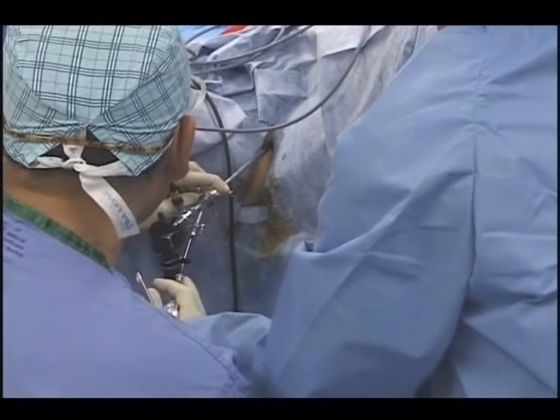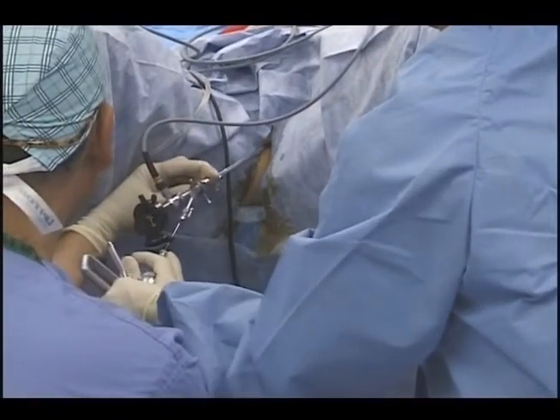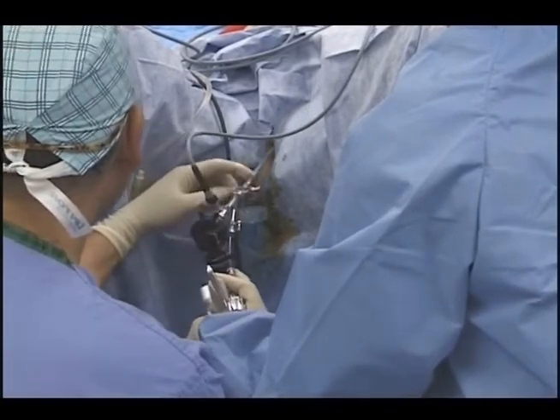Begin by locating the 6 o'clock position. Using the tunneling technique, tilt the scope to a 30 to 45 degree angle. While keeping the needle bevel facing the urethral lumen, insert the needle tip into the urethral tissue and advance the needle to the first circumferential mark, or approximately one-half centimeter in depth. Return the scope to zero degrees.